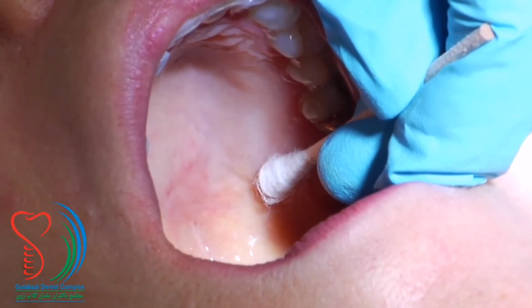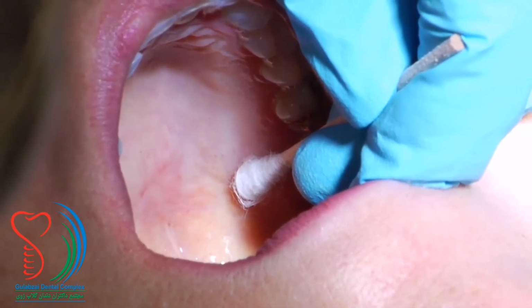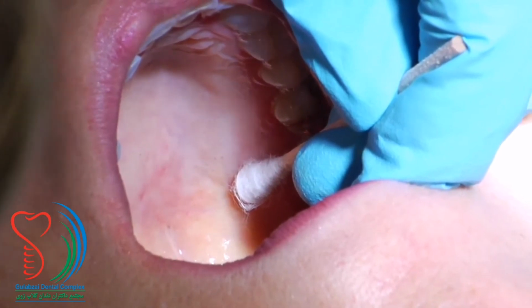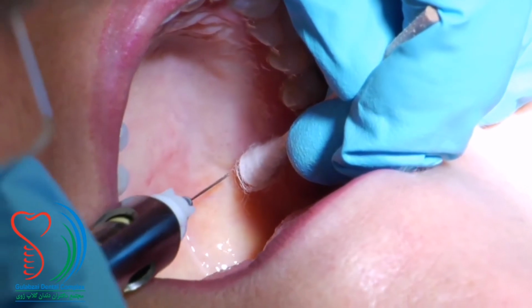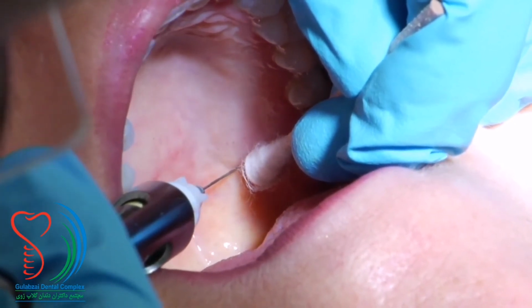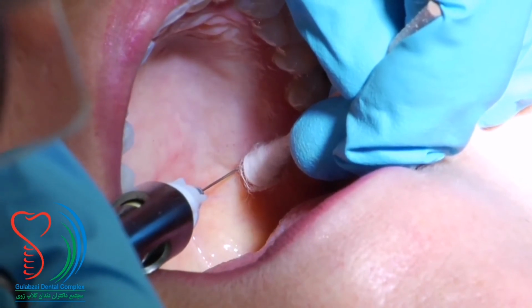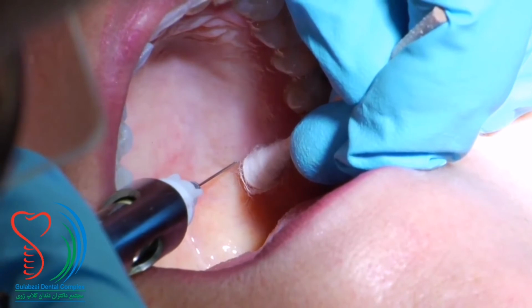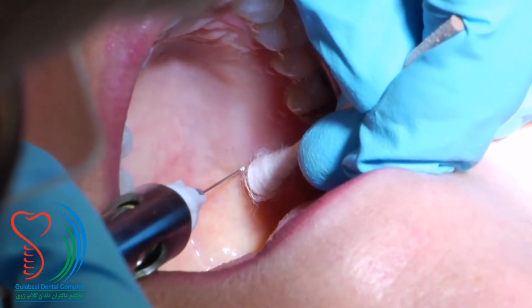You will be applying your pressure anesthesia with the cotton end of a swab after you've applied topical for a period of time. You'll place the bevel of your needle flat against the tissue, next to the pressure point or as close as you can get it, and hold the needle in such a way that you don't penetrate the tissue, but exert pressure on the plunger so you're dispensing a small quantity of anesthetic over several seconds.